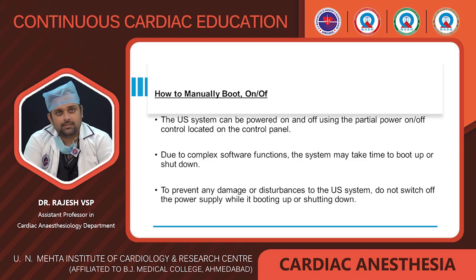Coming to first, how to manually boot, that is switch on and off. The ultrasound system can be powered on and off using the power on/off control located in the control panel. Due to complex software functions, the system may take time to boot up or shut down. To prevent any damage or disturbances in the ultrasound systems, do not switch off the power supply while the system is booting or shutting down.